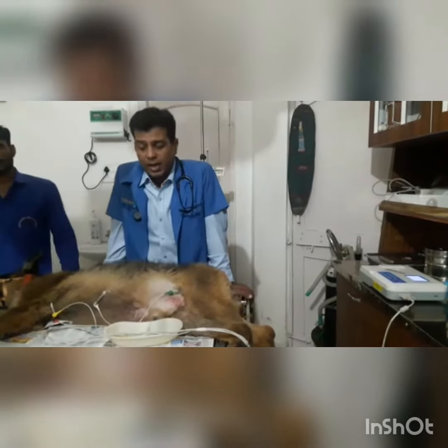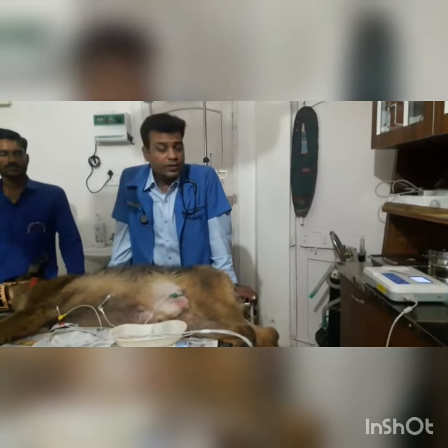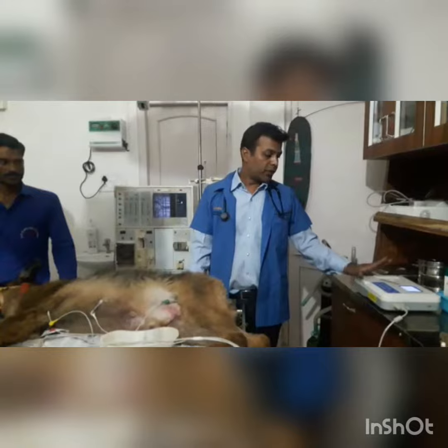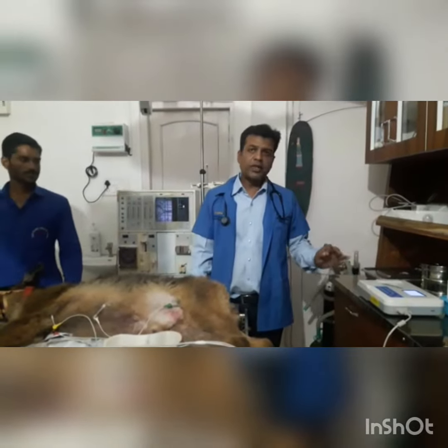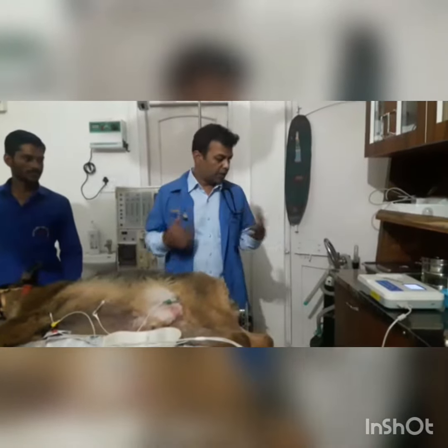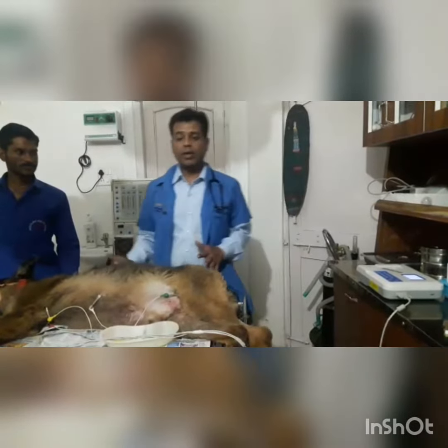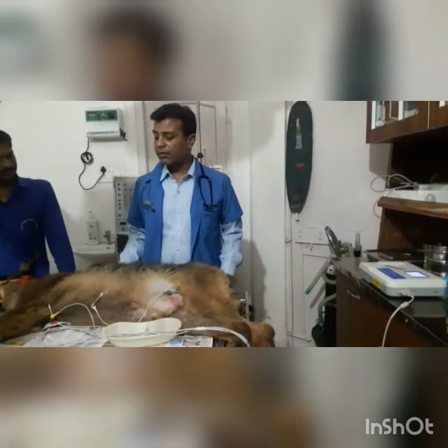Now I am taking this ECG. For taking an ECG, we need a veterinary model machine for dogs. There is a three-channel machine. There is a basic difference between the ECG machine for a dog and a human — in humans there are 10 clips, while in a veterinary machine there are only 5 clips.